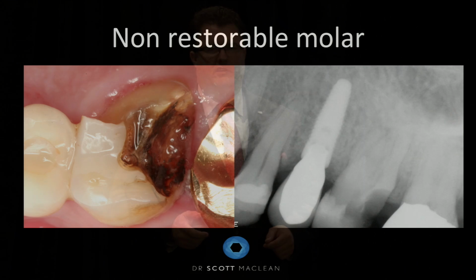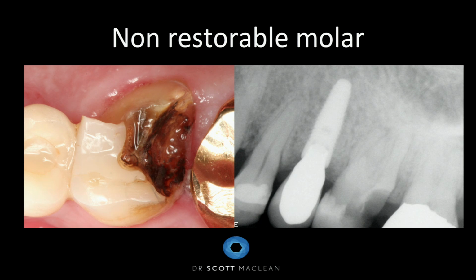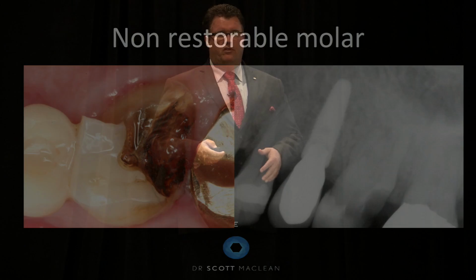If we look at this case, which I did a few weeks ago, we can see that the molar is non-restorable. This patient came into my office in the morning and is a radiologist, and so wanted to have this dealt with right away. So rather than take the tooth out and leave the patient, I'm going to take the tooth out, place the implant, and get this into a very minimal amount of bone with a high success rate.